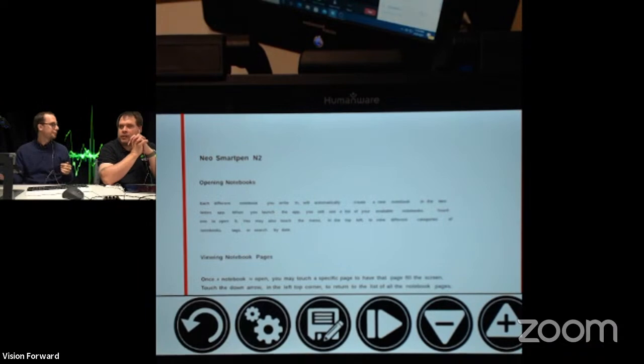That's a cool thing to know, that even though it's OCR mode and you think immediately that it's to read back, it doesn't have to be. Exactly. If you're struggling with a piece of paper, because the text is harder to read, taking a snapshot and having it converted to computer font could be awesome to then just read yourself. And there are different ways to do it with this.